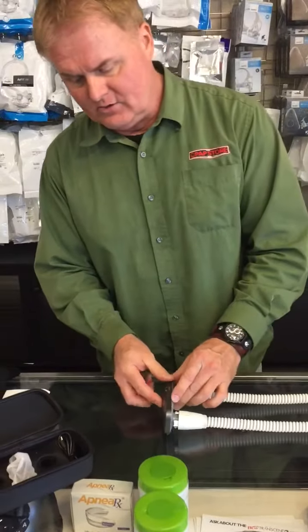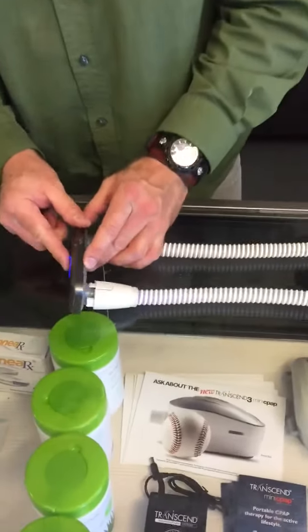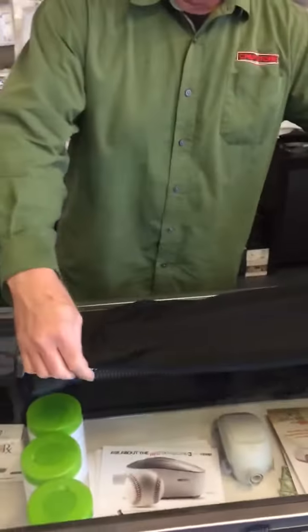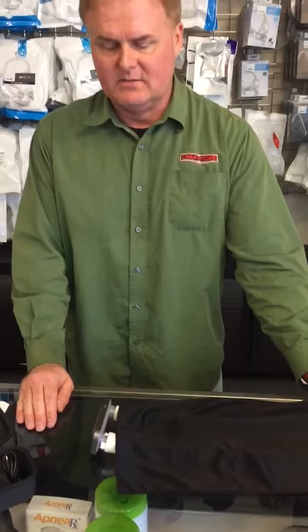Then you can turn on the device by holding down the button. Once the light is blue, it is on and emitting ultraviolet rays. You also want to put the blanket over your hose like so, and the device will automatically turn off after about three minutes approximately, and then your hose is ready to be used.